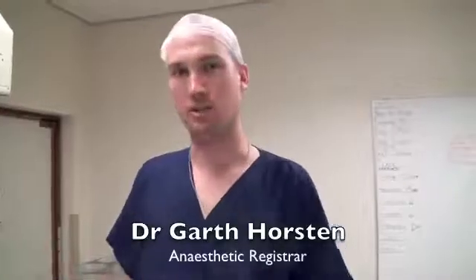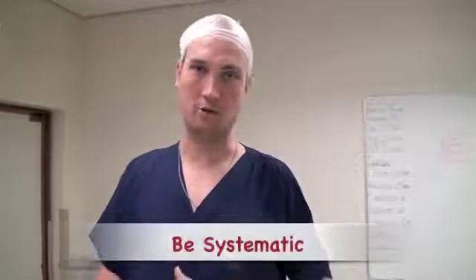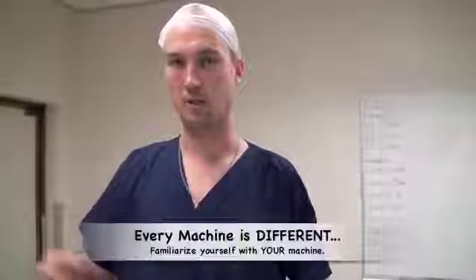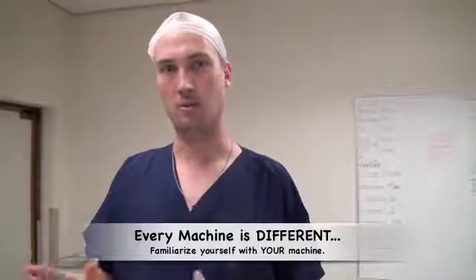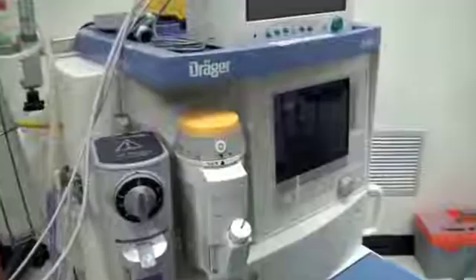When you're learning how to check an anaesthetic machine, the first thing to remember is that every machine is different and you need to have a systematic approach to checking any machine. Some machines have checklists that come up on them — some you just read and do on your own, others require actions and confirmation. So it's important to be able to test the most basic machine all the way through to the most complicated machine.